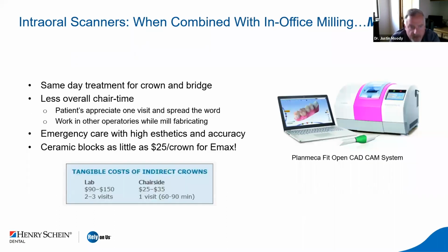So when we introduce these intraoral scanners into our practice, some docs will just take the advantages that we just talked about: less shipping costs, faster turn times, incorporating into a dental laboratory, and using it that way.